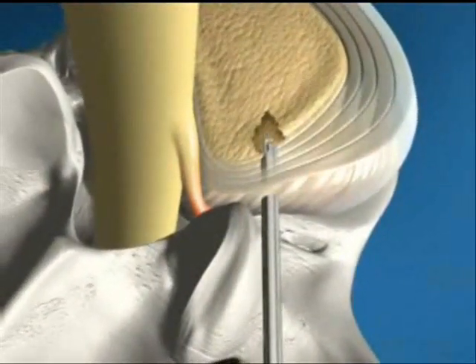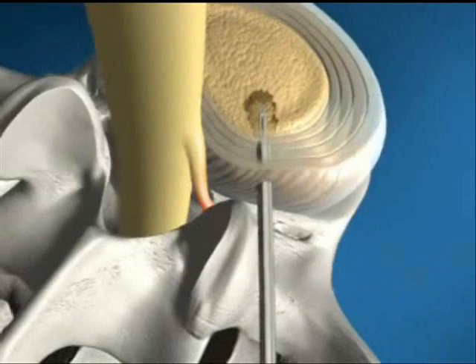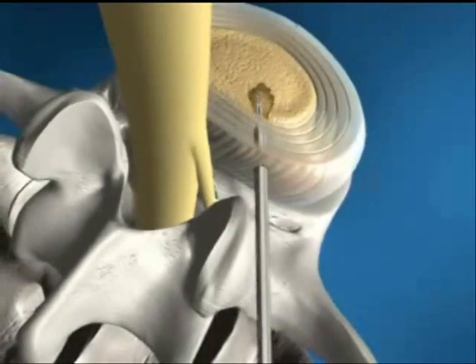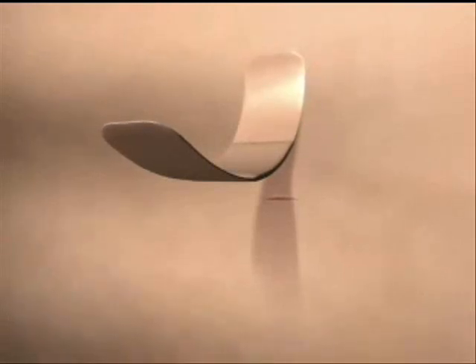Immediate relief of pain is often noted postoperatively. Patients are released approximately two hours after the procedure and can resume daily activities in about two weeks. The hydrodiscectomy procedure is a minimally invasive procedure which does not call for an incision or stitches. A band-aid is all that is required to close.